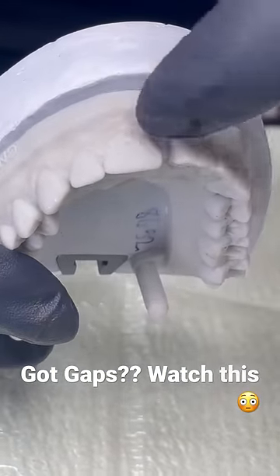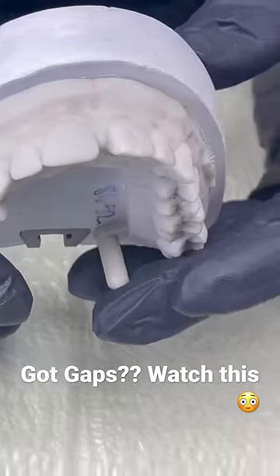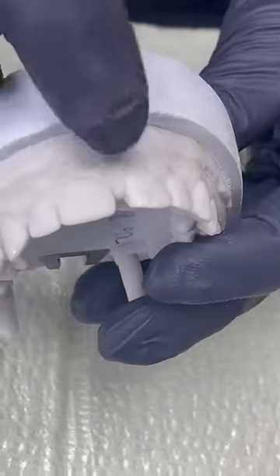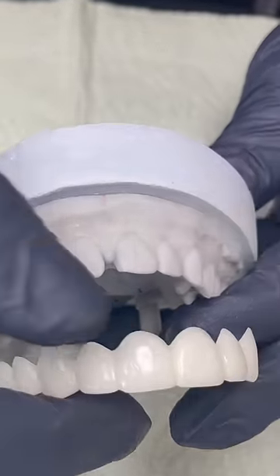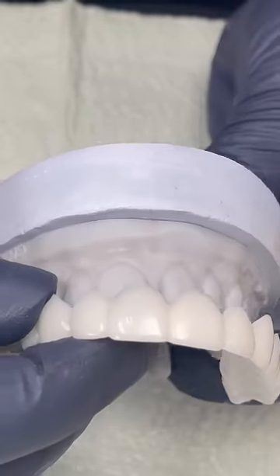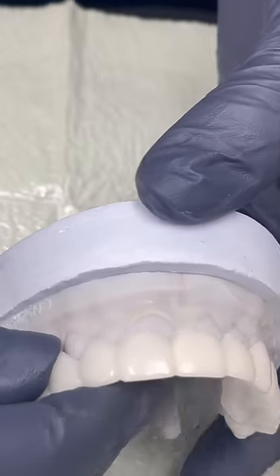Here's her model. She's got a big gap. The challenge is to make an appliance that doesn't look too wide. So what we did is we superimposed teeth over the existing teeth.